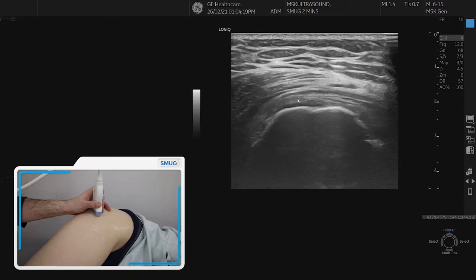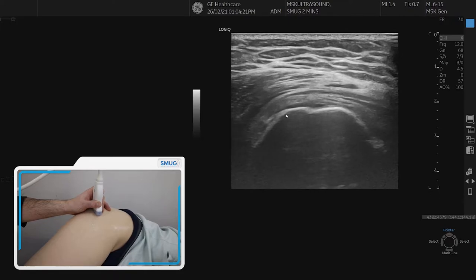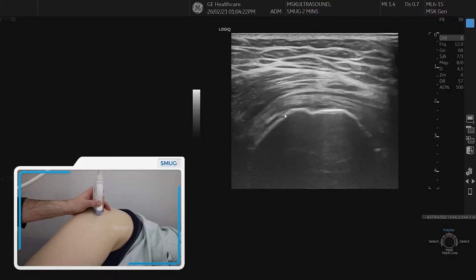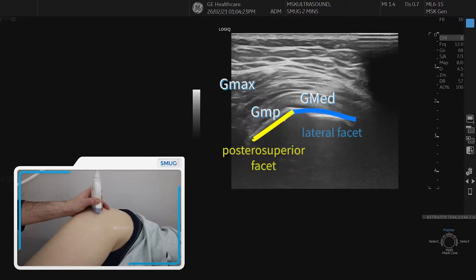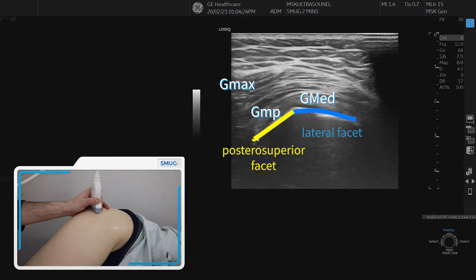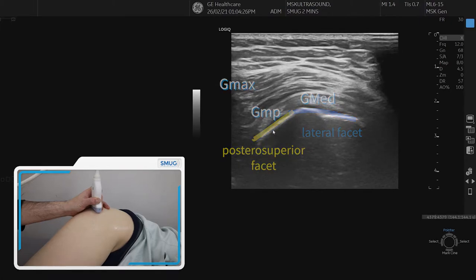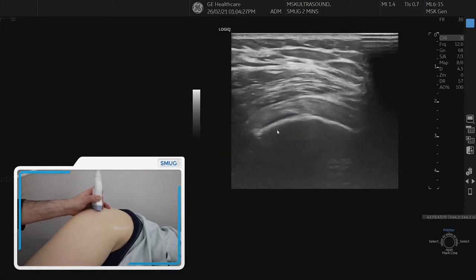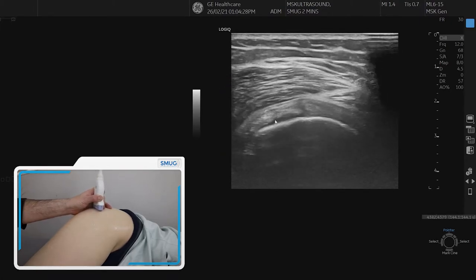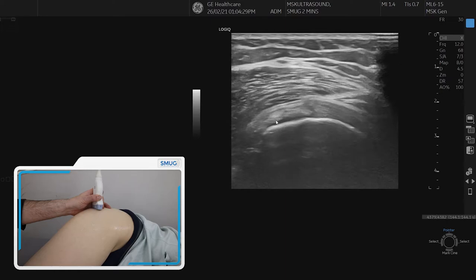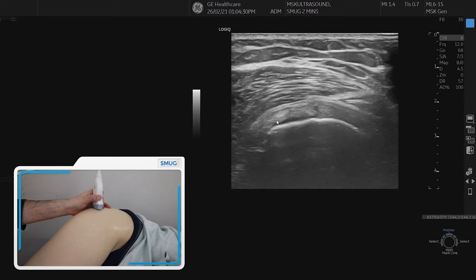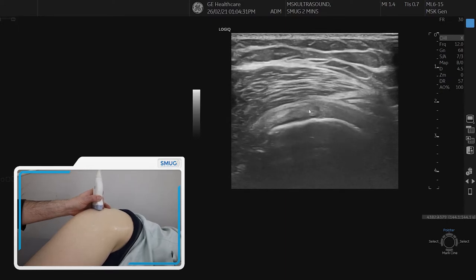Line up the tendon there, which is then the lateral facet of the greater trochanter, and then this straight-looking posterior facet is for the posterior band of the glute minimus. So that's your deep layer.